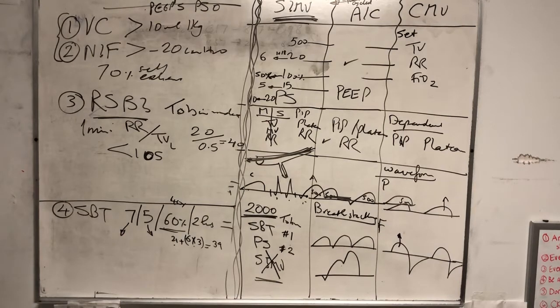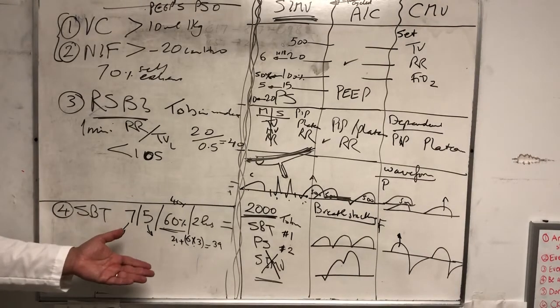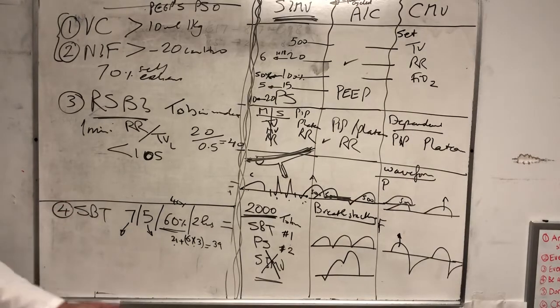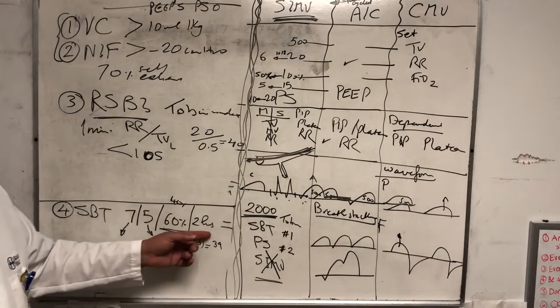Because we know that we want to extubate the patient to nasal cannula, so we want to do the test at this level and basically put the patient on 40% and see if he gets extubated or not. If he can't tolerate it, then we wait. Right now we have 15 liter nasal cannula and 70 liter nasal cannula. Why would you apply the same harsh test? We like the patient. We want to extubate the patient. We want to make the test easy. So I think it's no problem to go 60% very easily.